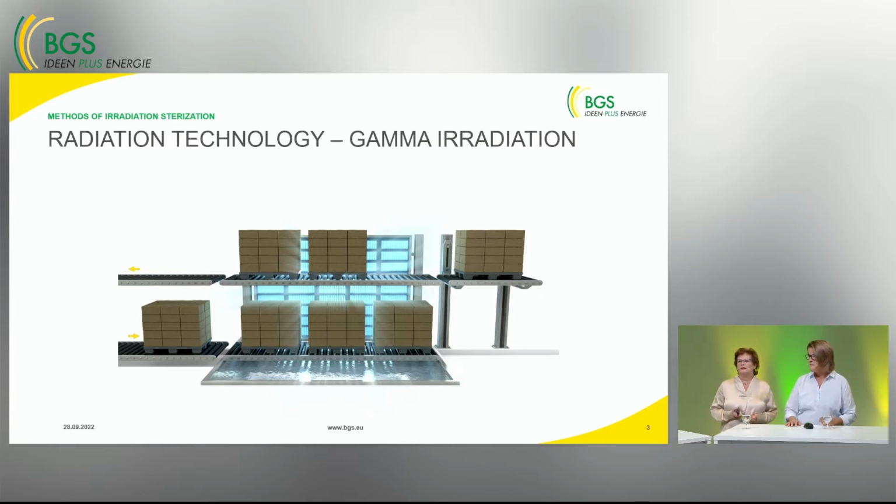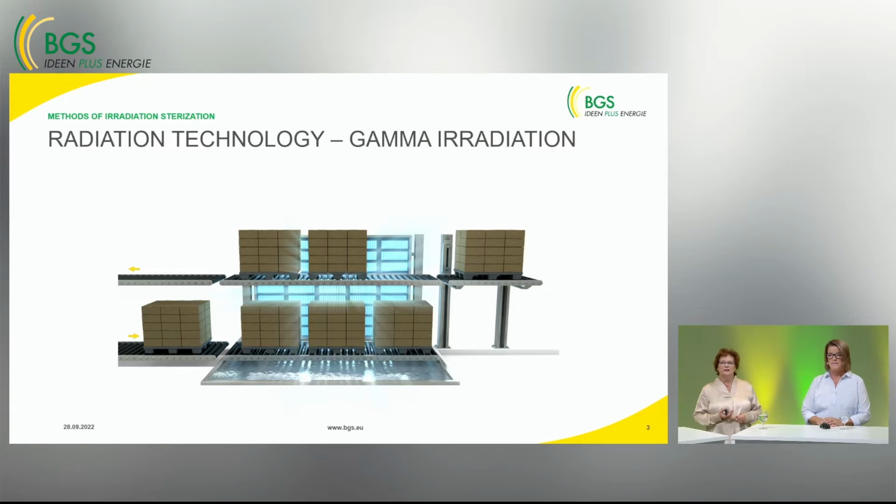Products to be sterilized are transported through this radiation field via a fixed pre-specified path. In the process, the necessary radiation dose is applied to the product. The common dose range in terms of gamma irradiation to achieve sterility is around 20 to 50 kilogray, and the irradiation time takes several hours.